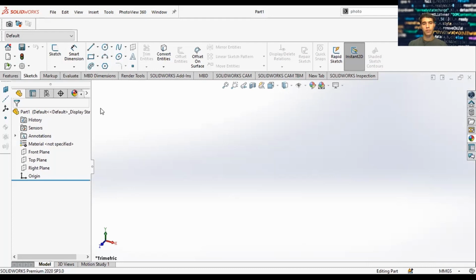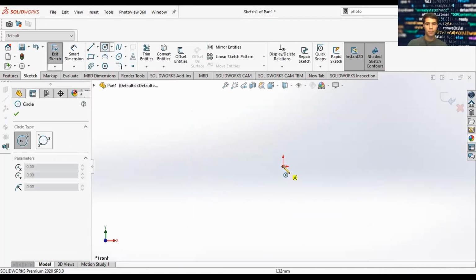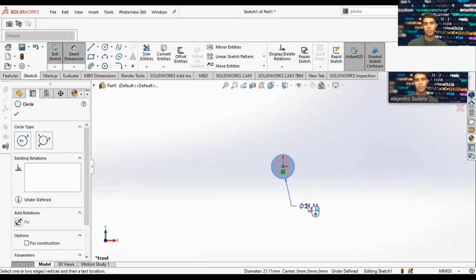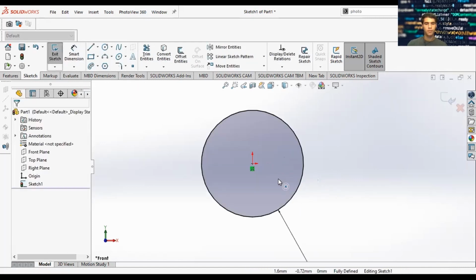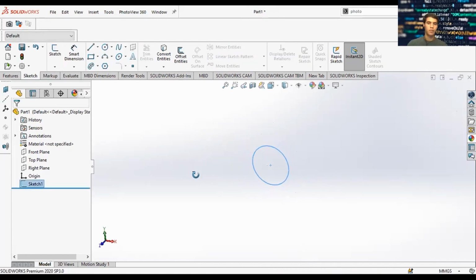If you notice, for the embolization device, the specs were a 5mm diameter and a 10mm length. So we're going to go ahead and model that. We check that our units are MMGS, millimeter gram second. It's a 5mm diameter. That is good. But the first thing we want to do is add an axis, and this will come in useful later.